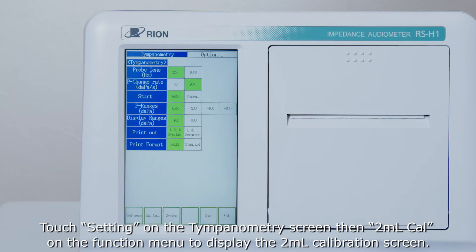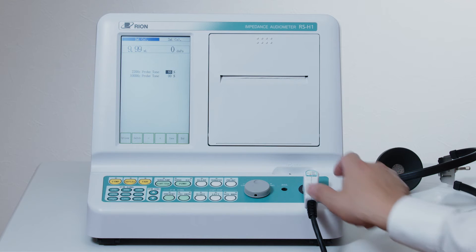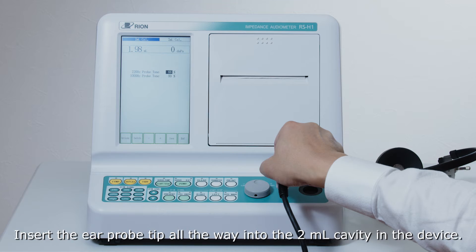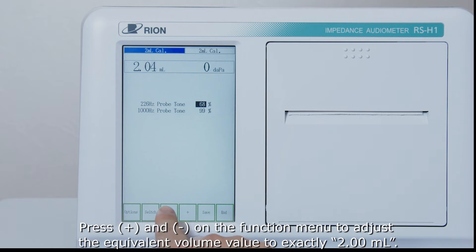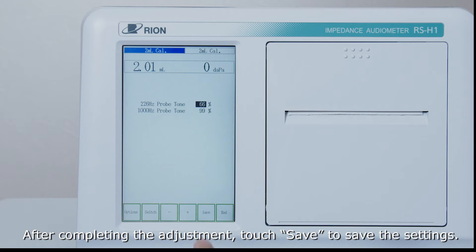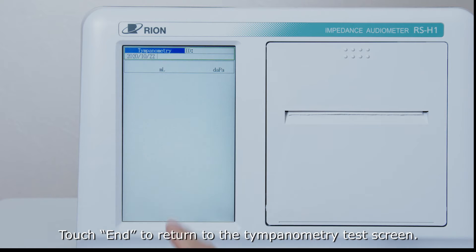To calibrate, touch Setting on the tympanometry screen, then 2ml Cal on the function menu to display the 2ml calibration screen. Insert the ear probe tip all the way into the 2ml cavity in the device. Calibration is performed when the probe frequency is 226Hz. Press plus and minus on the function menu to adjust the equivalent volume value to exactly 2ml. After completing the adjustment, touch Save to save the settings. Touch End to return to the tympanometry test screen.